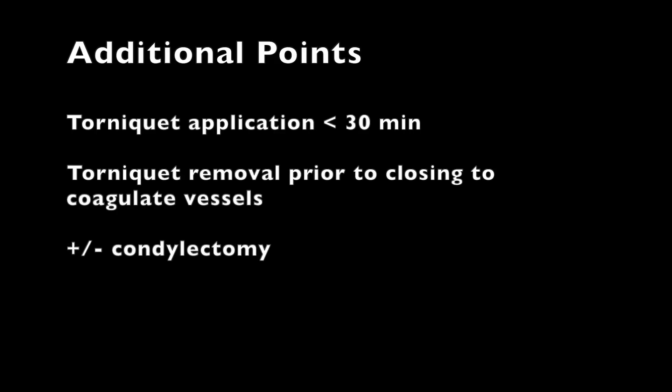A couple of additional points: you want to keep the tourniquet application and therefore the procedure time relatively short — ideally less than half an hour. The tourniquet can be removed prior to closing in order to identify any hemorrhage and achieve good hemostasis with electrocautery or vessel ligation.